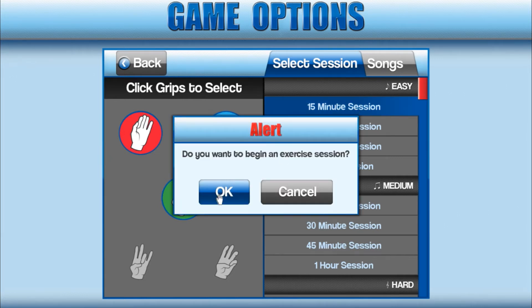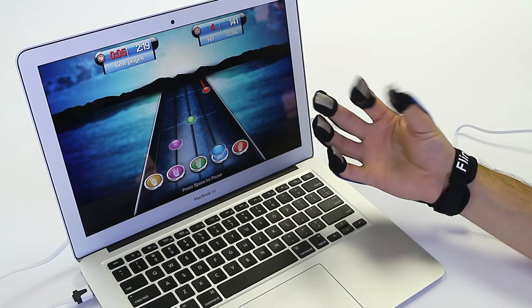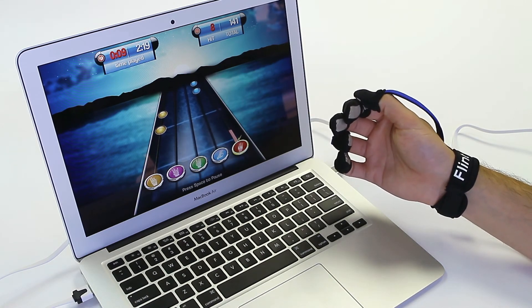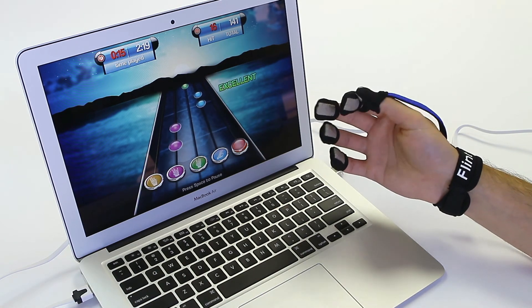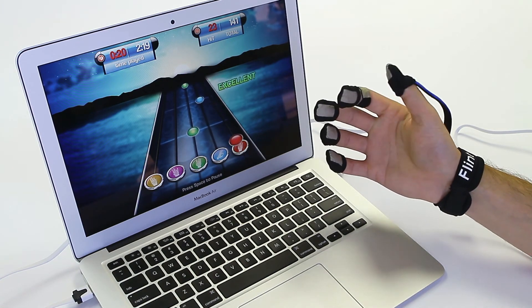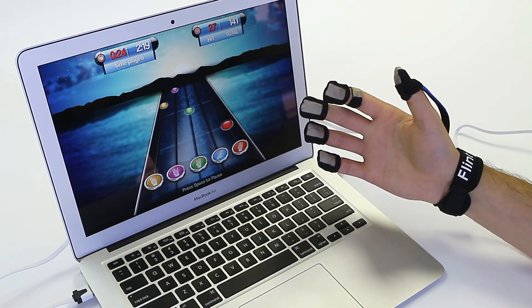In the game screen, you must make the appropriate grip when the colored dot passes through the respective circle on the bottom of the screen. When you see a note with a tail, you must hold the appropriate grip for the duration of the tail. Start by focusing on a single grip until you're able to hit at least 50% of the notes for that grip. Do not be discouraged if you're only able to hit a few notes per song. As you continue practicing, your performance will improve.